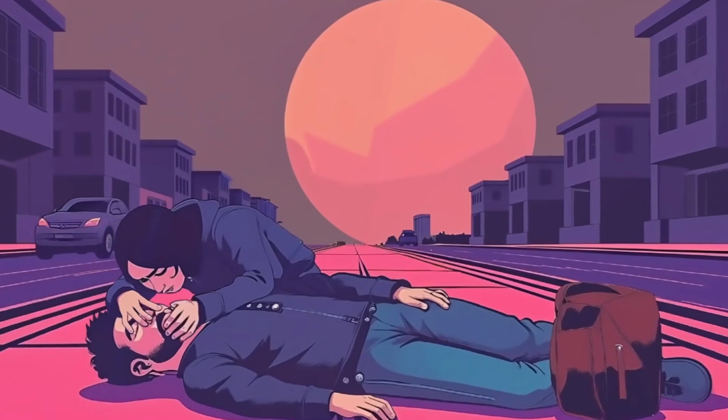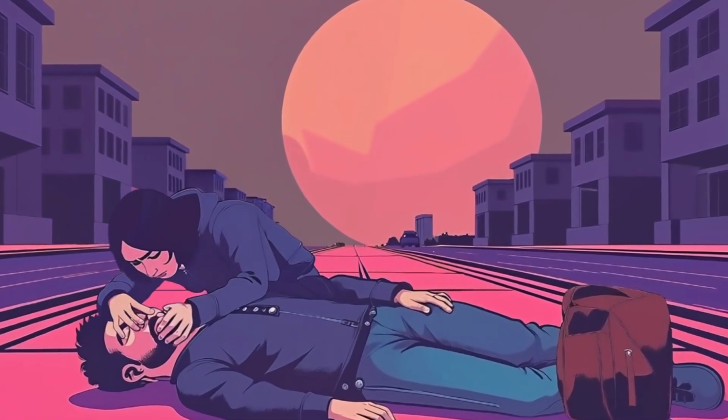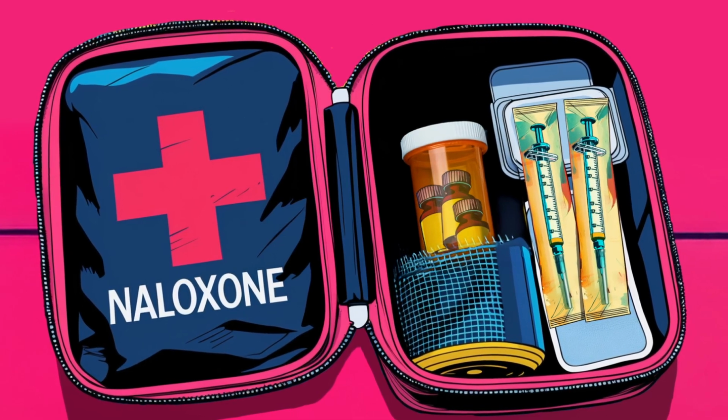After giving naloxone, perform rescue breaths until the person starts breathing again. If they do not breathe after 3 minutes, give another dose of naloxone.